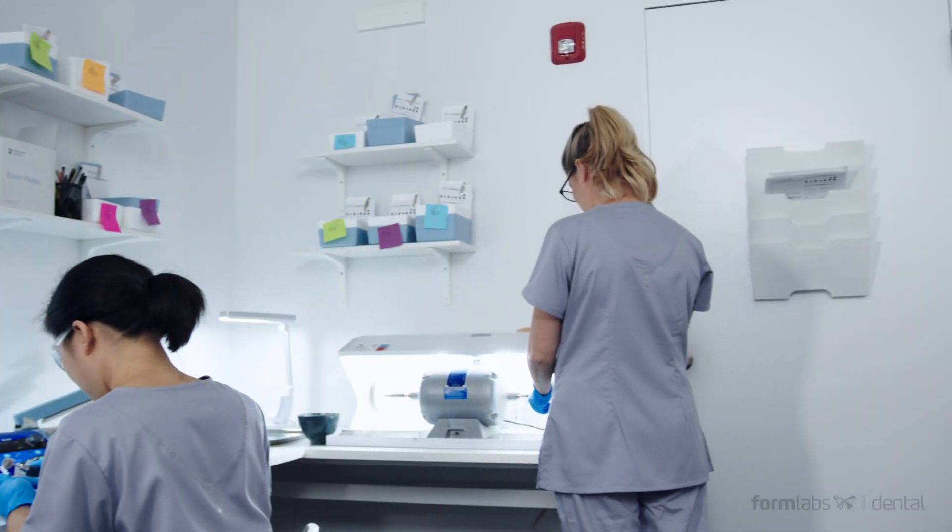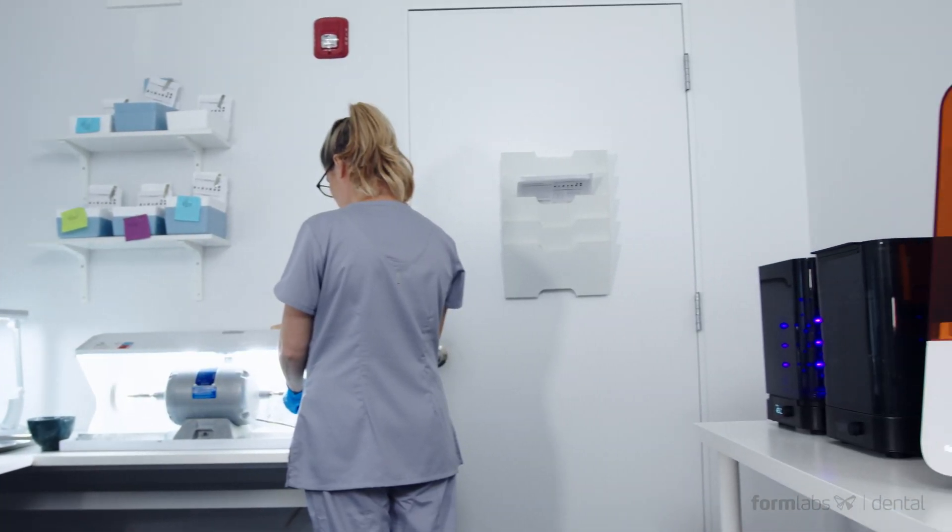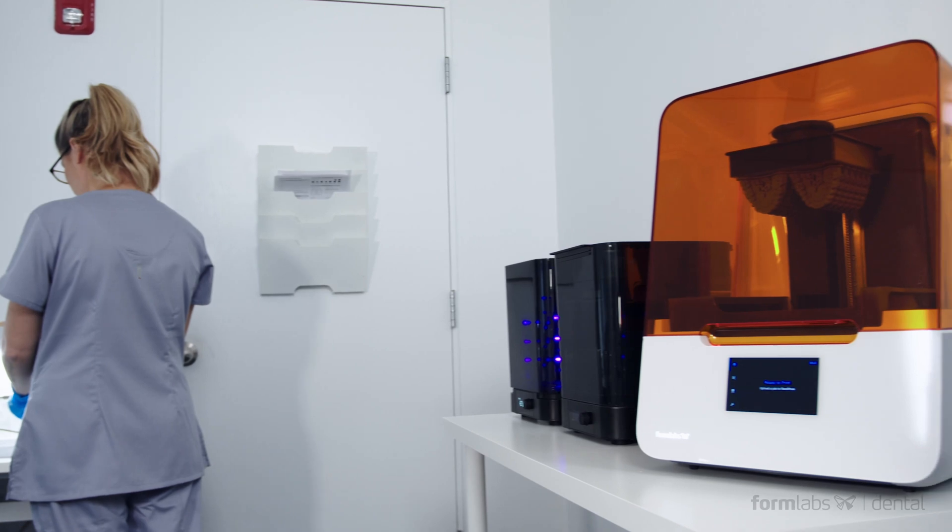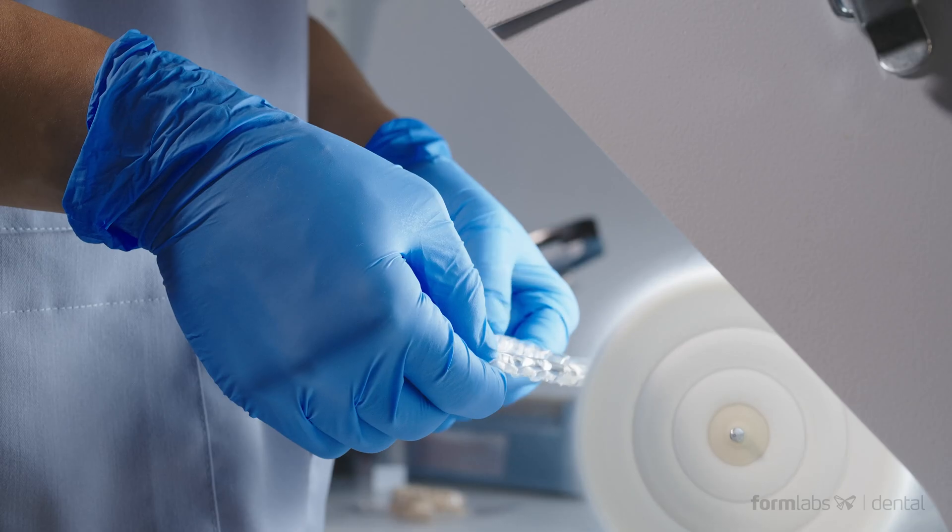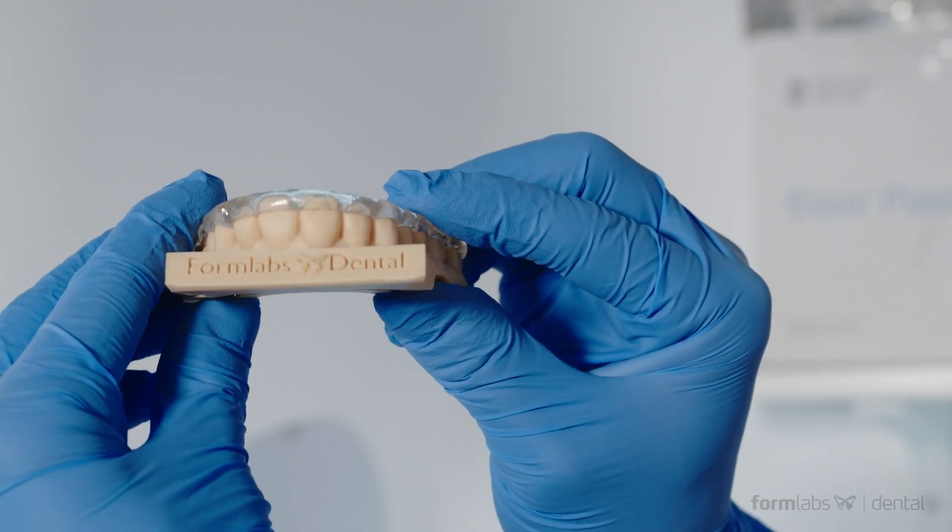The flexibility, speed, and ease of use of the Form 3B are a perfect match for the unique needs of an orthodontics practice, where throughput and reliability are key.